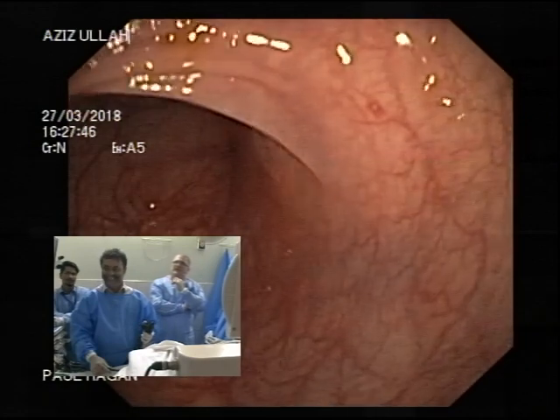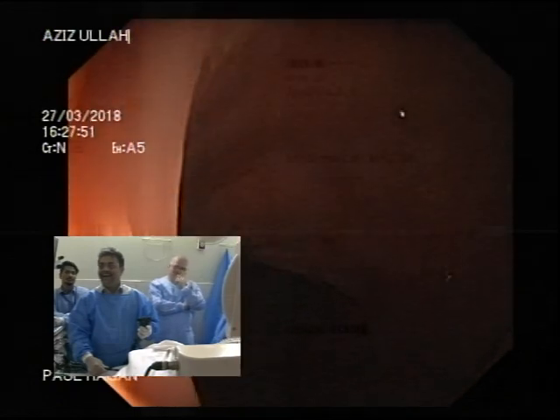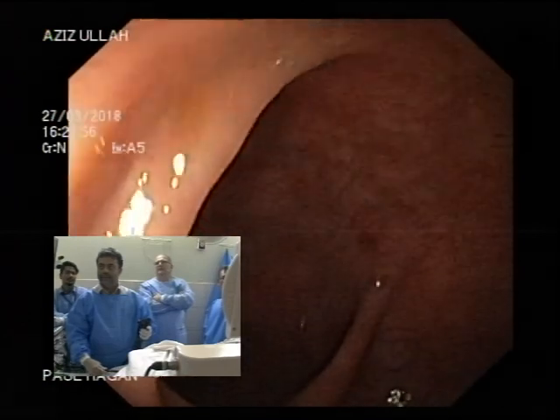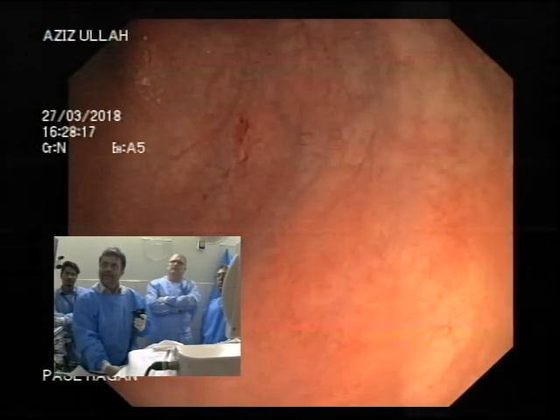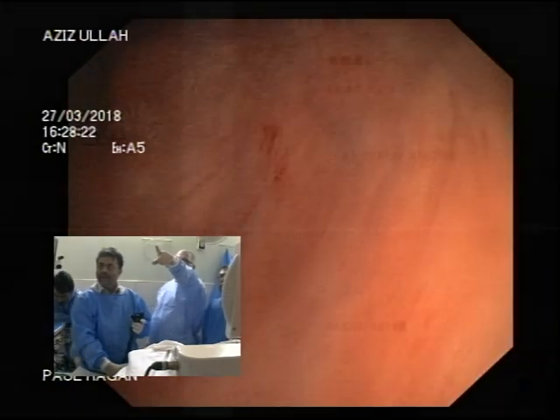Good man. Now you can do all that stuff you were saying. Good. So, big wheel back. And now small wheel reach across. And big wheel and little wheel all the way back. Advance the scope. Clockwise torque. Advance the scope. So you can see what's causing his bleeding problem.